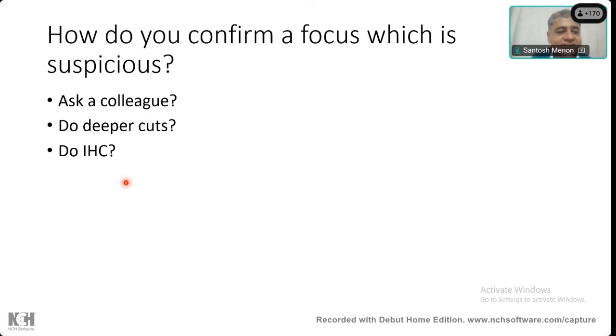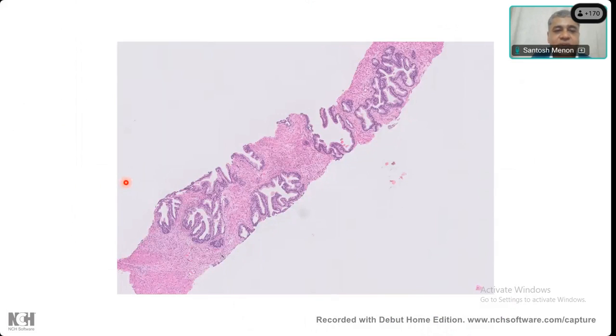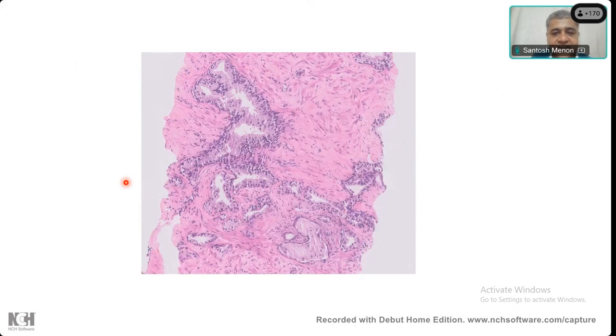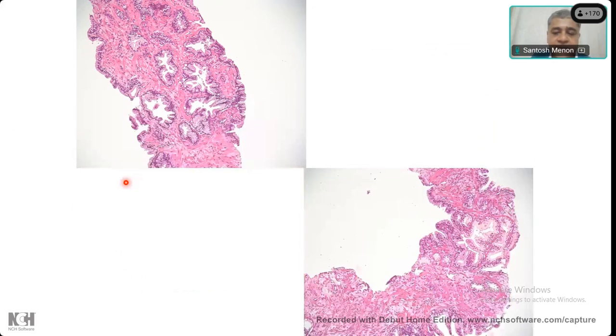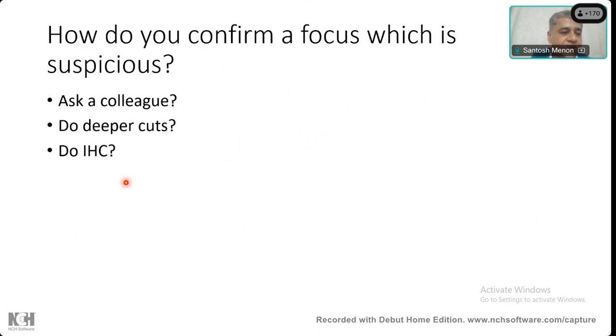I think it's generally a good practice always to do deeper cuts for a prostate. It's a standard practice in most of the centers; in fact, most of the centers would supply deeper cuts along with the main sections, especially if they're lengthy and good sections. So it's important for you to know that it is not very uncommon and it's very easy to do deeper cuts to look at the focus which is suspicious.